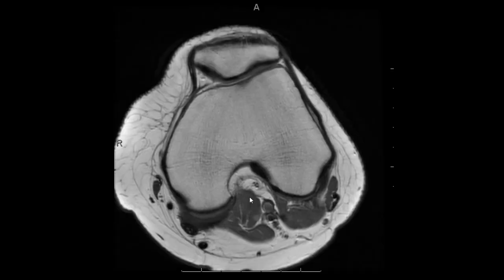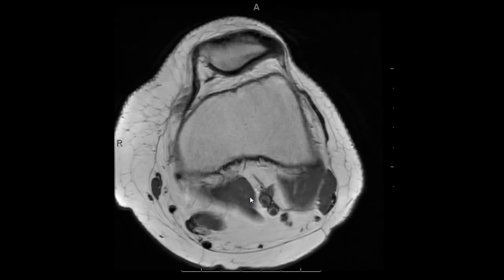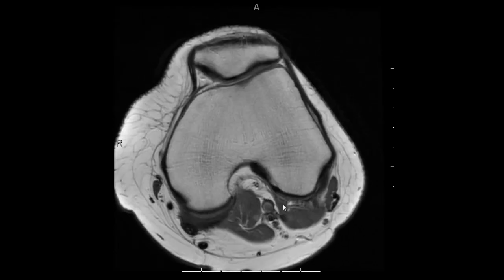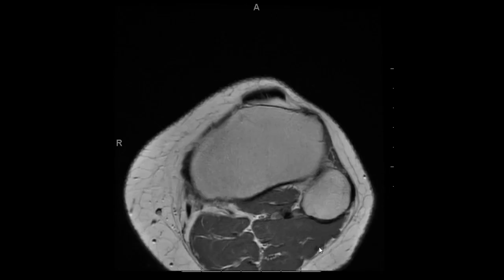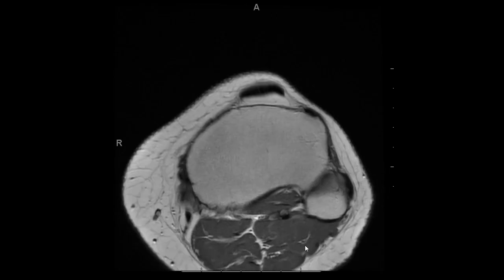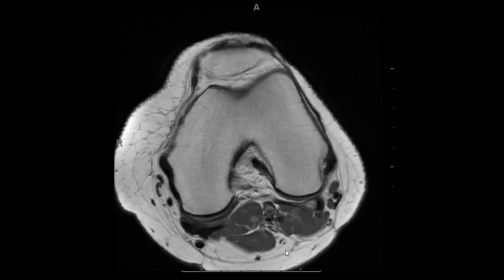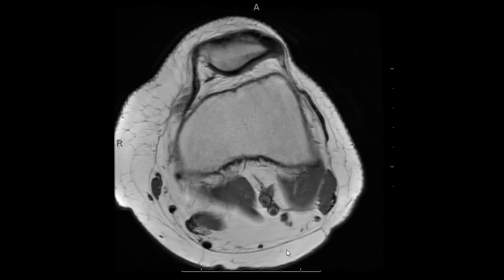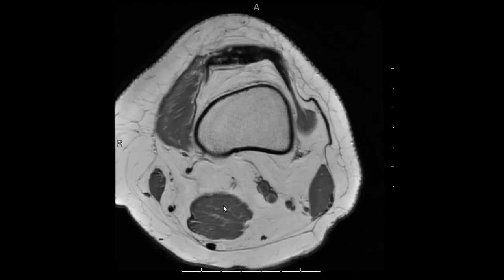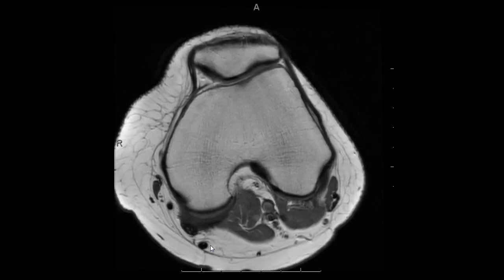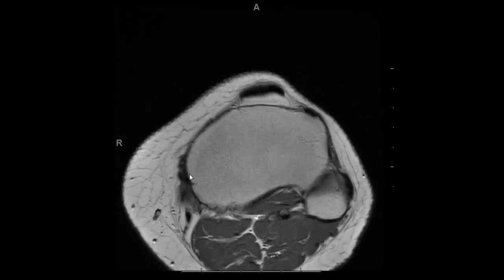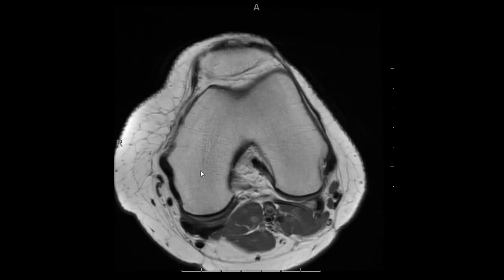The axial plane is a good one to evaluate muscles and neurovascular structures. You can see all the aforementioned muscles here: the medial and lateral gastrocnemius, the popliteus muscle, the biceps femoris, the semimembranosus, the sartorius, the gracilis, and the semitendinosus tendons and muscles extending down to insert on the pes anserine on the medial tibia.